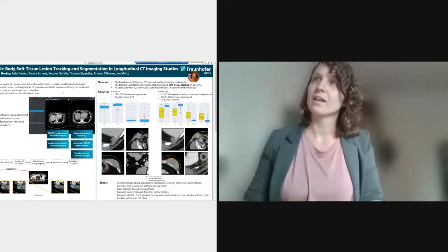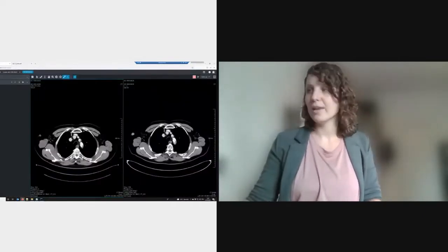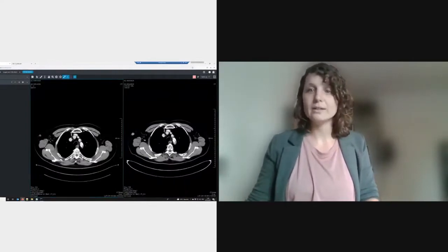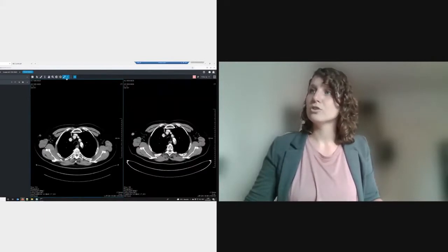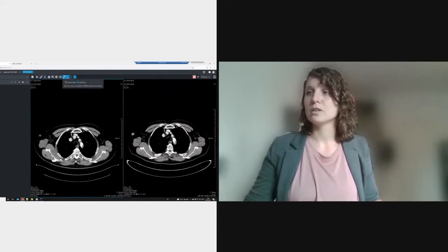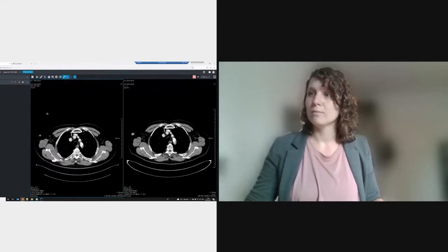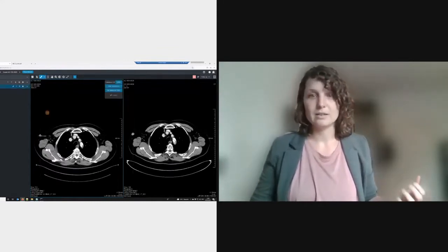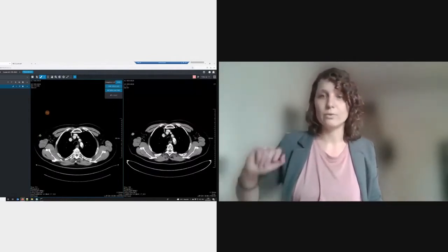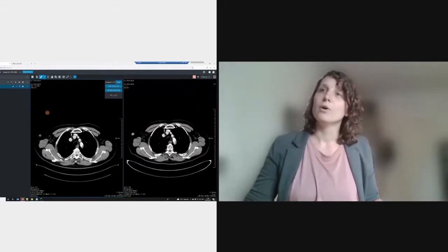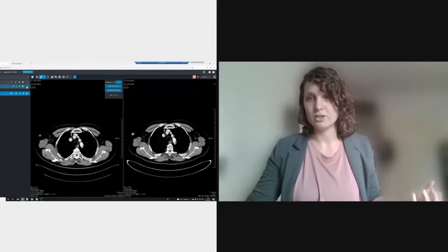Here we have our baseline scan on the left and the follow-up scan on the right. There is a soft tissue lesion which we want to segment. We choose the lesion type — soft tissue — and then click into the lesion. The lesion is automatically segmented on the fly, so nothing is pre-computed here. The diameter is measured, and a structure is created to archive and save the lesion.